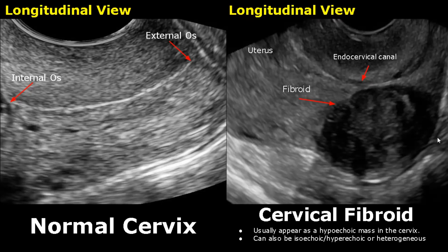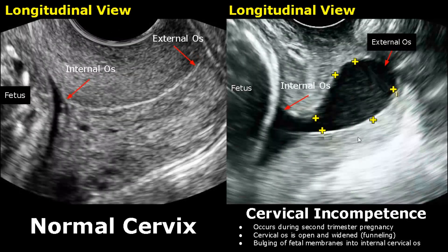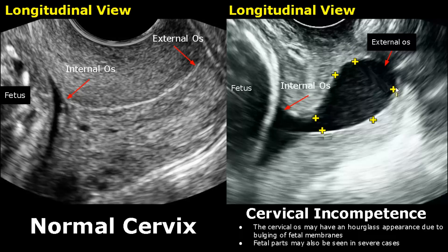In cervical incompetence, the cervix becomes dilated and this can cause second trimester pregnancy failure. The cervical os will be open and become widened. This widening is called funneling, and is due to bulging of fetal membranes into the internal cervical os. The appearance of the cervical os can have an hourglass appearance.